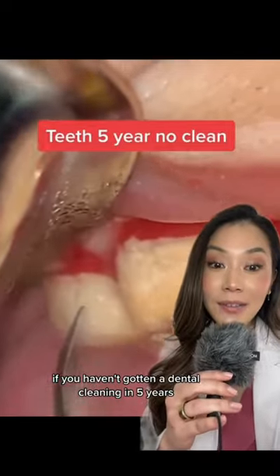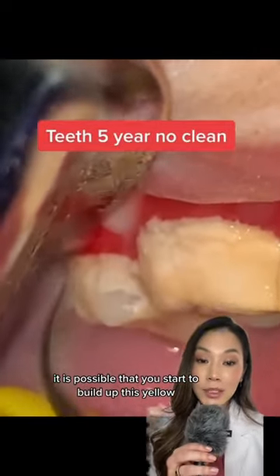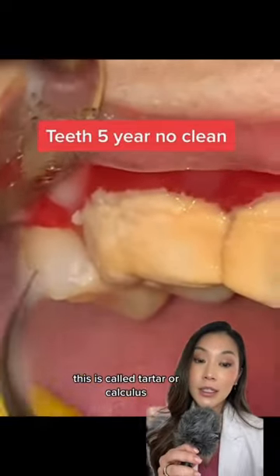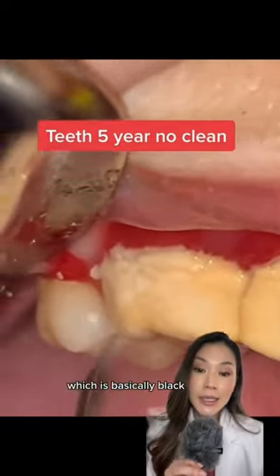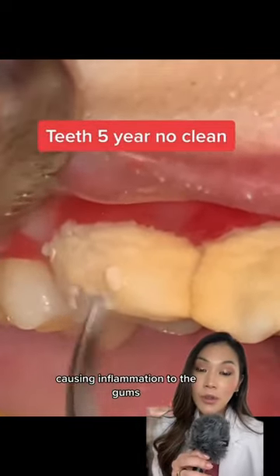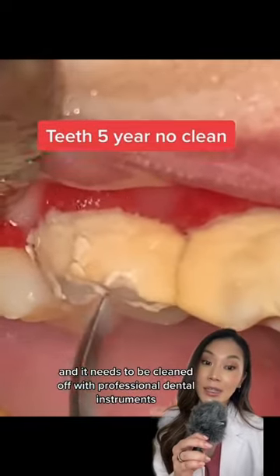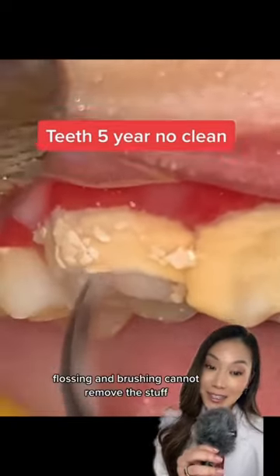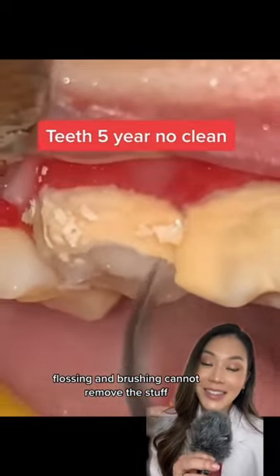If you haven't gotten a dental cleaning in five years, it is possible that you start to build up this yellow-like substance around the teeth. This is called tartar or calculus, which is basically plaque that has hardened by the minerals in the saliva, causing inflammation to the gums. It needs to be cleaned off with professional dental instruments — flossing and brushing cannot remove this stuff.